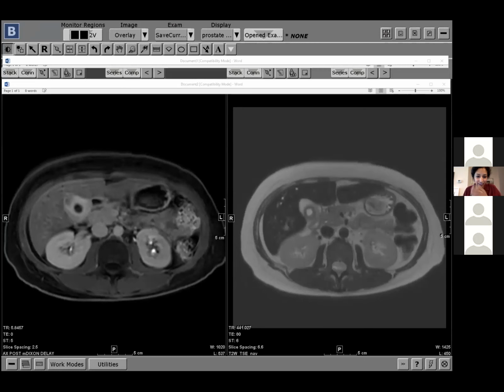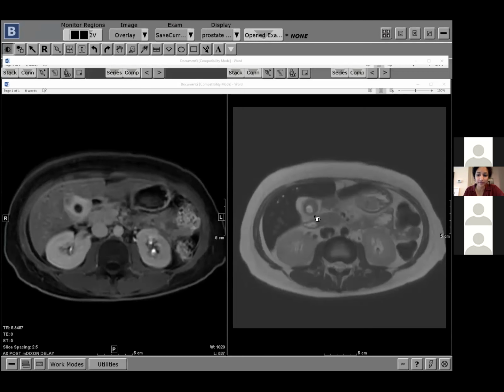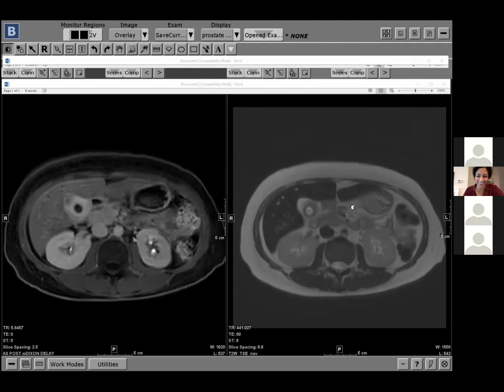Awesome. Yeah, I think it would look really unusual for gallbladder cancer because the mucosa looks intact. Right. So we basically read it as something unusual, but the main thought was maybe some sort of infiltrative lymphoma or leukemia. All right.